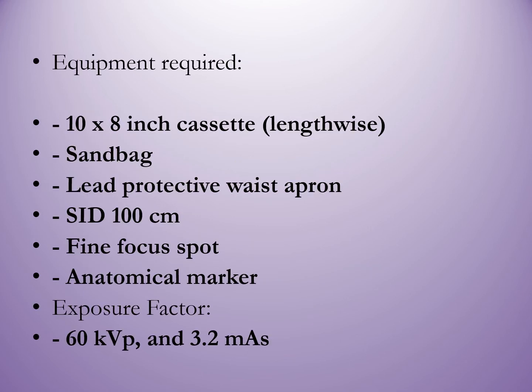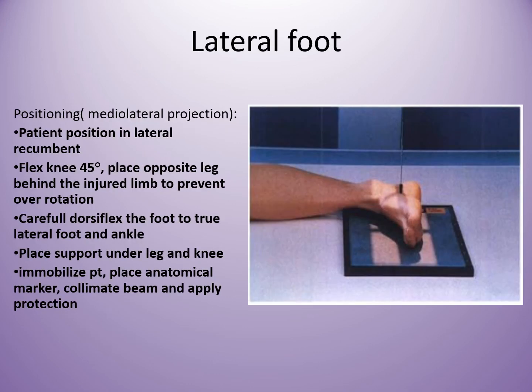Alright, lateral foot equipment is the same as when we do the foot. Technical factors are more or less the same, except you have to modify the exposure factors a bit because the thickness in AP is different compared to the lateral side, a bit higher. And the lateral foot positioning, how do you position? Like we do the ankle, but you are focusing on this anatomy, instead of the ankle, you go for the foot itself.